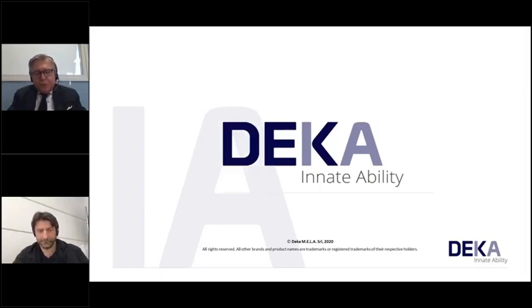the fractional CO2. We have in the old SmartXide dot only SP. With the new SmartXide square, punto, touch, and tetra, we would use DP, but even SP is important. SP pulse. For the wrinkles, we use a very important dwell time.